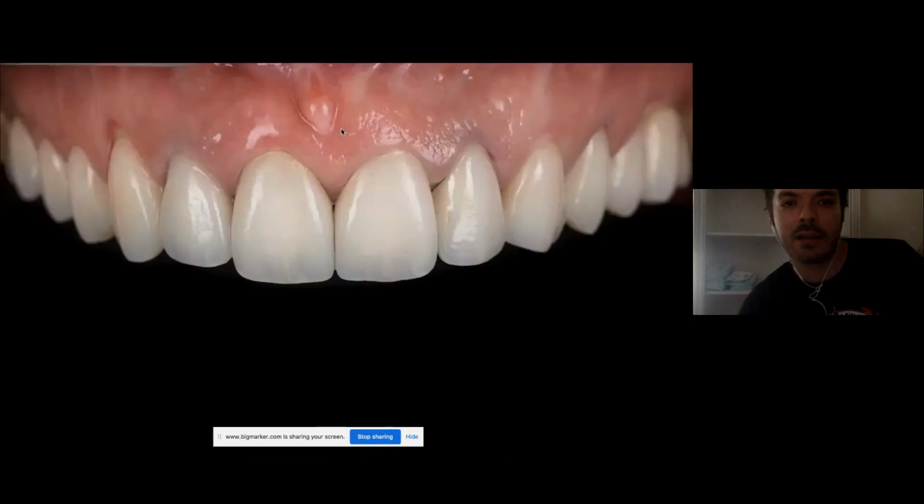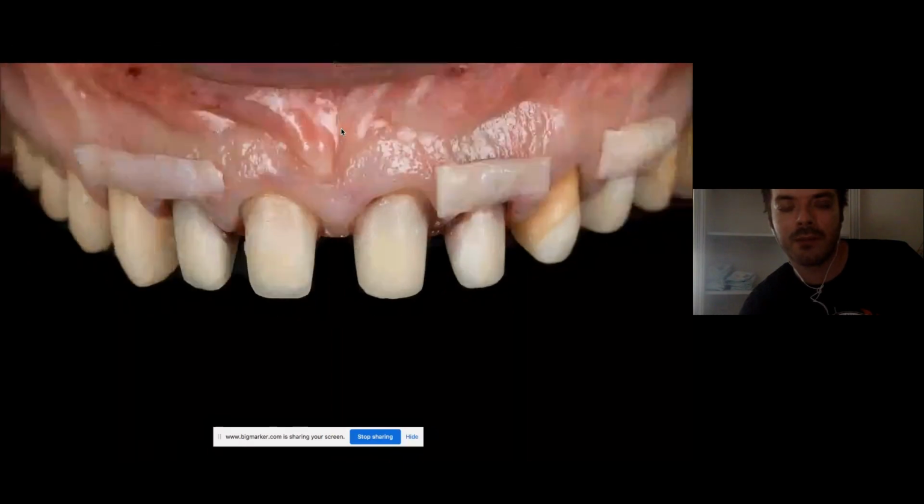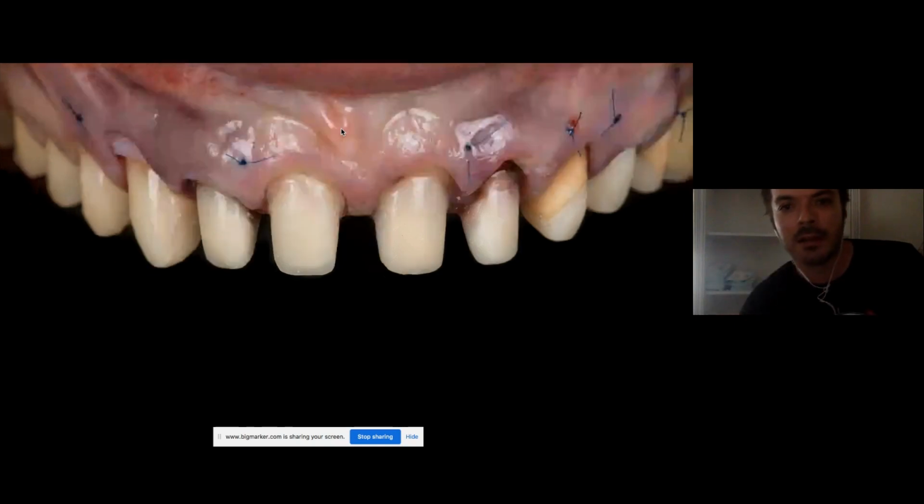And then the last thing we have to do is to manage the tissue, the color of the tissue. Did the try-in and everything was okay. Here we had Gustavo and Marcelo Giordani. They took a graft. And there's an entire conversation here about what type of soft tissue graft is indicated. But basically, to make a long story short, you need a rich collagen graft that doesn't grow in this area, because you don't need volume, you just need quality to block and give a nice texture to the tissue.